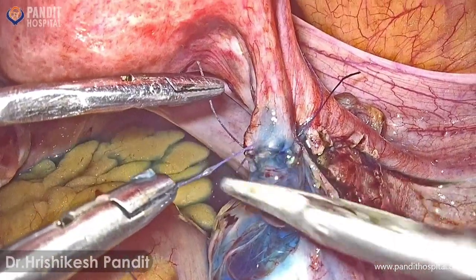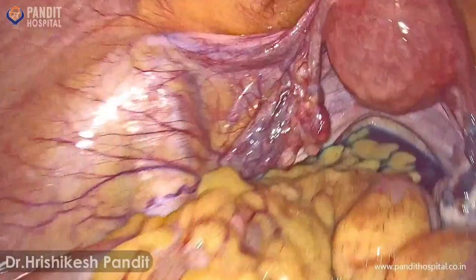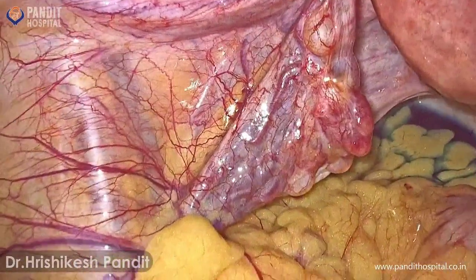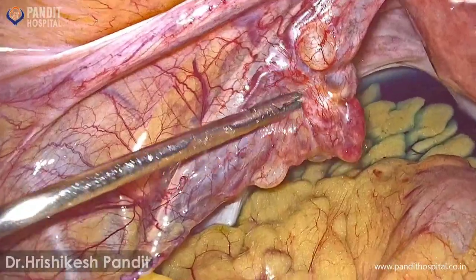As we had kept the 6 o'clock stitch longer while cutting, we have now tightened the serosal layer. You can easily observe that methylene blue is coming freely from the fimbrial end.